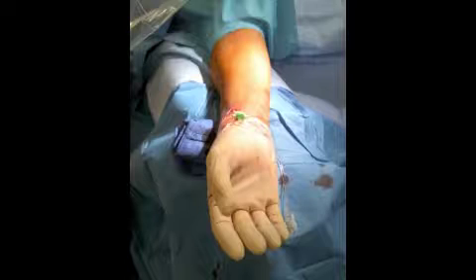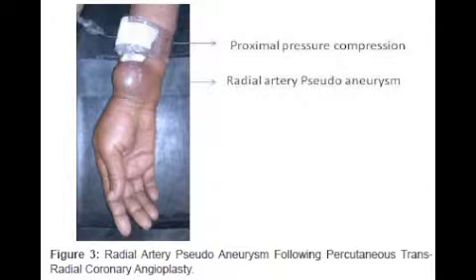It's another popular site for physicians, but the most popular for patients. This site does require an Allen test, which I'll demonstrate for you shortly. This route is preferred among patients because of reduced bed rest times and the reduction of the possibility of a painful clamp being put over a femoral site because of bleeding. This site does carry the same complications as the femoral artery, such as oozing, bruising, bleeding, swelling, and even risk for infection.